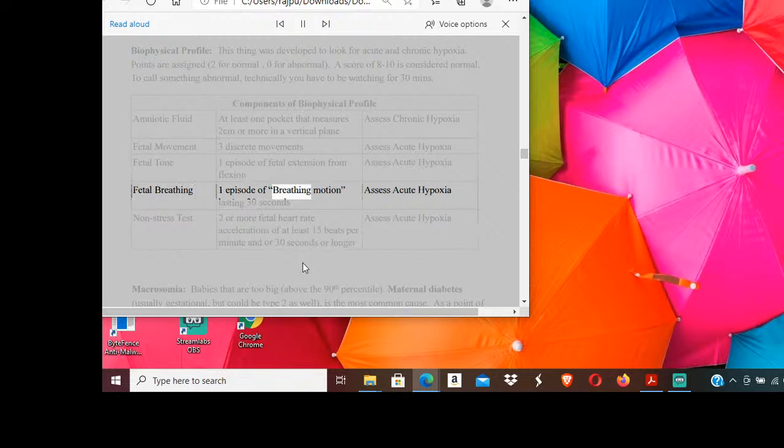Fetal breathing: one episode of breathing motion lasting 30 seconds. Assess acute hypoxia.